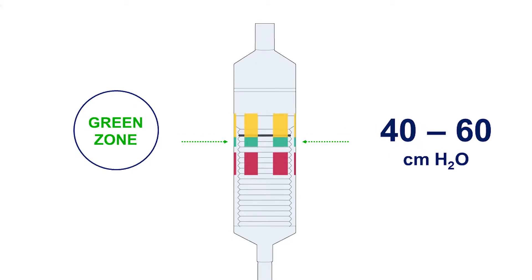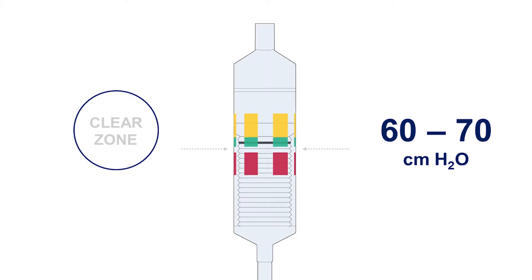The green zone designates optimal intracuff pressure of 40 to 60 centimeters of water. Air is introduced into the cuff of the laryngeal mask until the black line is within the zone and a seal has been obtained. The clear zone, located between the green and red zones, indicates intracuff pressures between 60 and 70 centimeters of water.